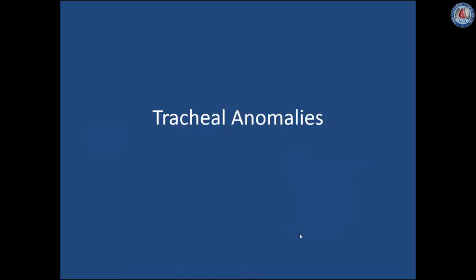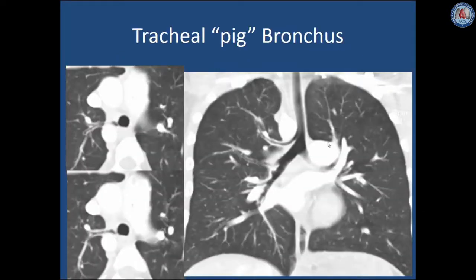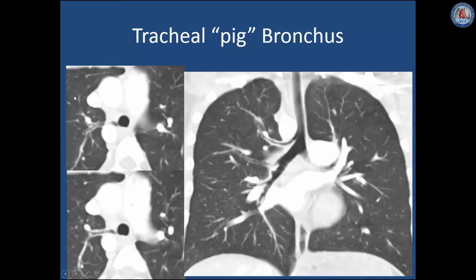There are some tracheal anomalies that we should be familiar with. The most common is the tracheal bronchus, otherwise known as the pig bronchus — a small bronchus that usually arises from the distal right lateral wall of the trachea, 2 to 3 centimeters above the carina, supplying a portion of the right upper lobe. A normally located right upper lobe bronchus will also be seen arising from the right main bronchus. On axial images we can see the small tracheal bronchus coursing into the right upper lobe. This has clinical implications in patients who will be intubated so that this bronchus is not occluded.